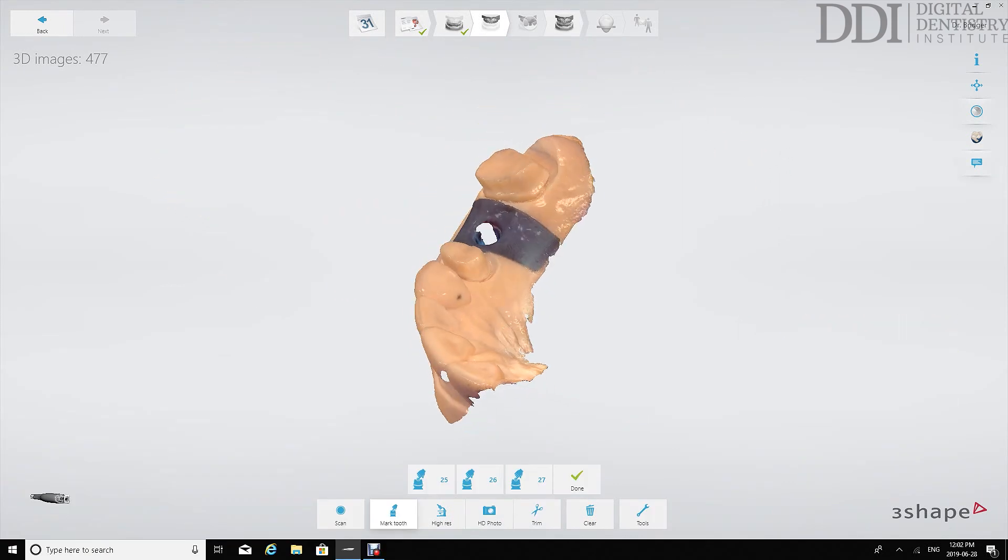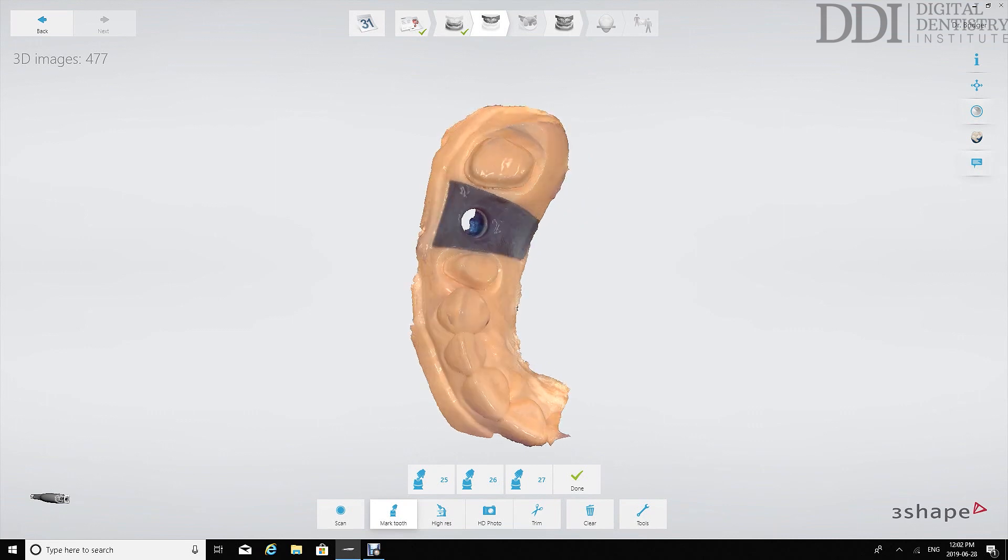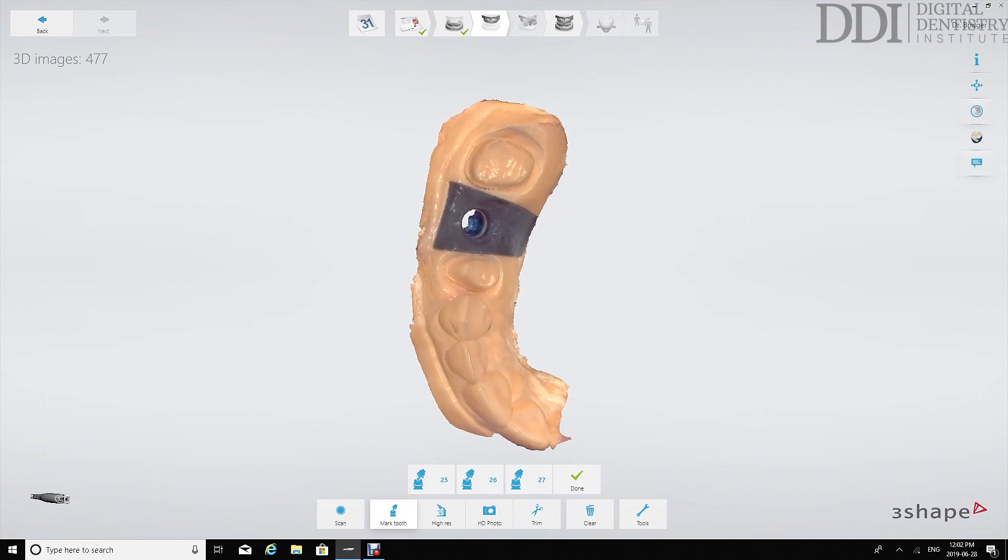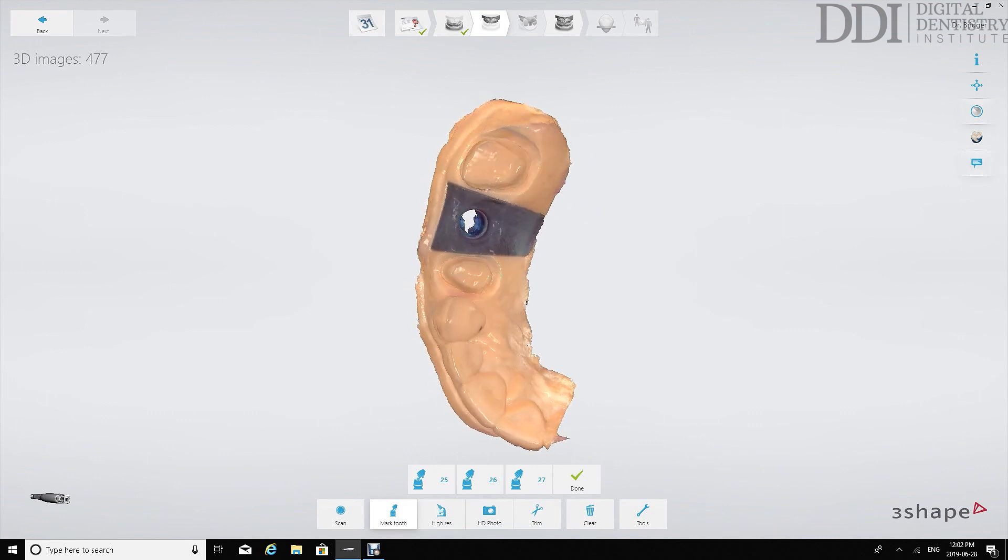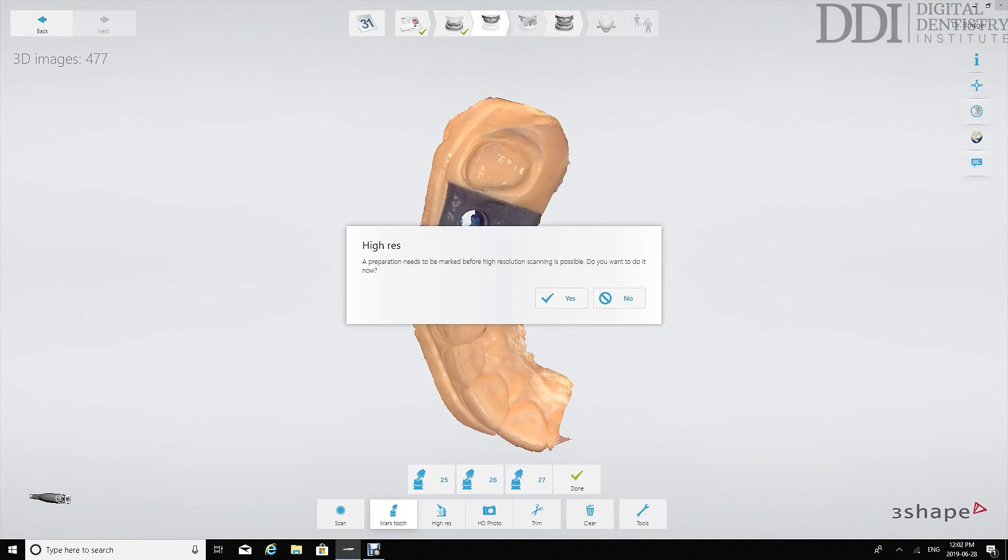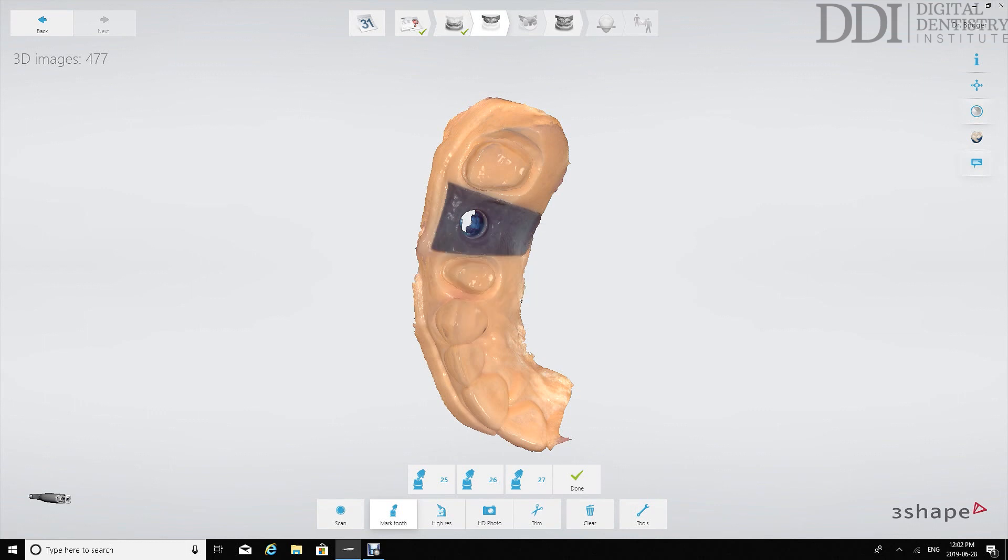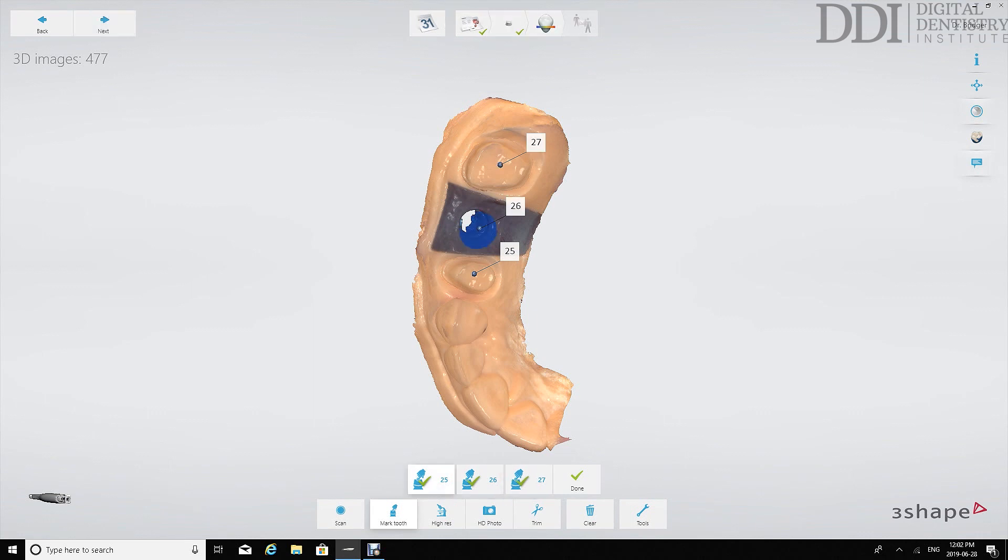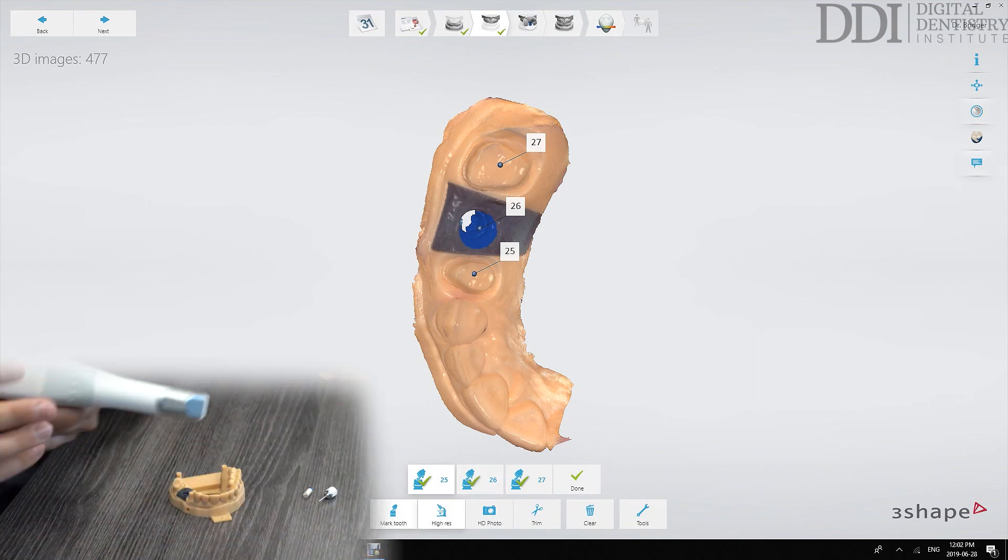So at this stage here there are a few options and tools we can utilize because we are scanning tooth based crowns. Number one being we can take high resolution scans of the margins. We have to mark the preparations first so we'll identify where 2.5 is, where 2.6 is and where 2.7 is.